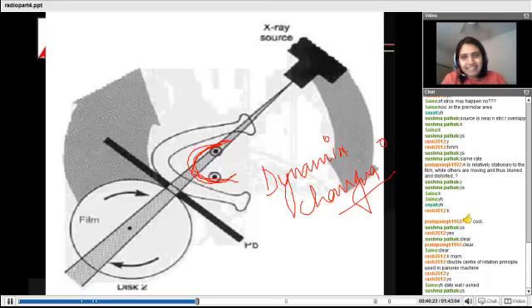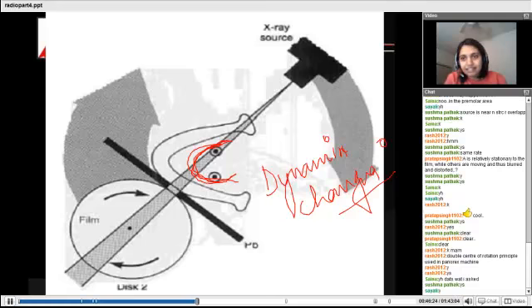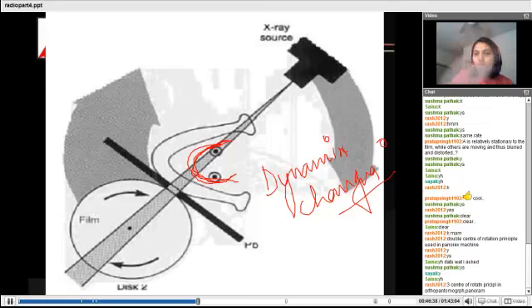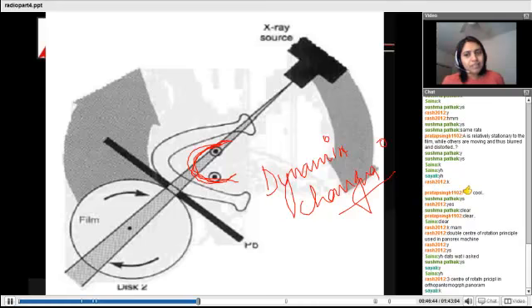Isn't it? If you imagine the scene. If there is a continuously changing center of rotation for each particular point, even if there is a little bit of blurring, the blurring will be so uniform. Yes, the three-center rotation principle, and then the dynamically changing center of rotation.